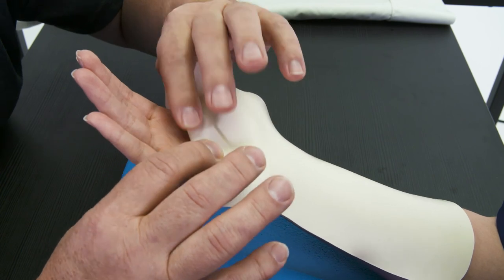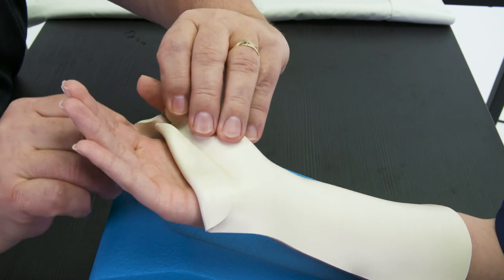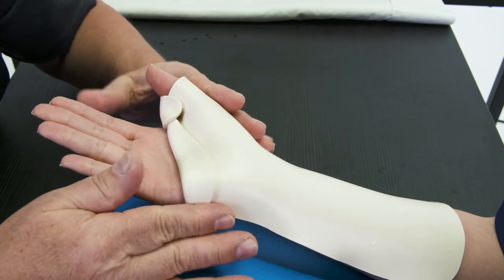Wrap the peninsula of the pre-cut around the thumb with the border of the material slightly distal or at the IP joint. Gently press the distal end of the peninsula against the underlying splint material, providing a temporary tack.